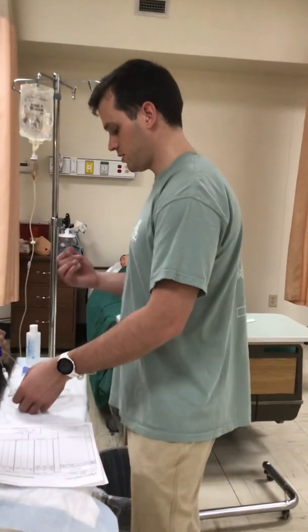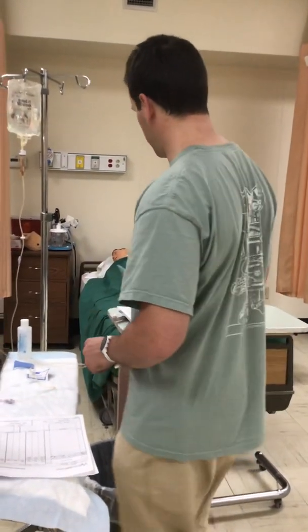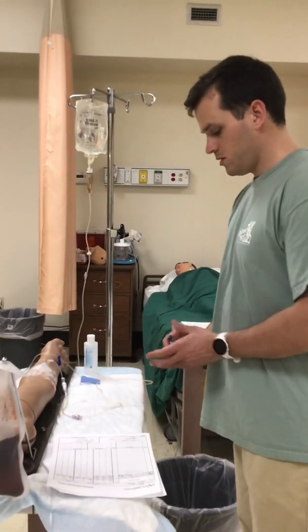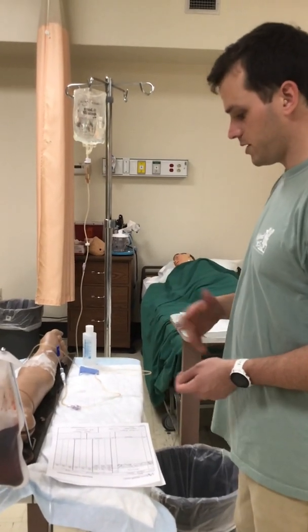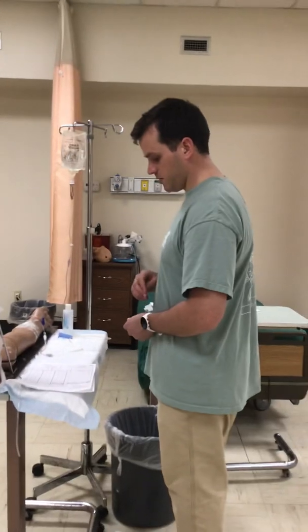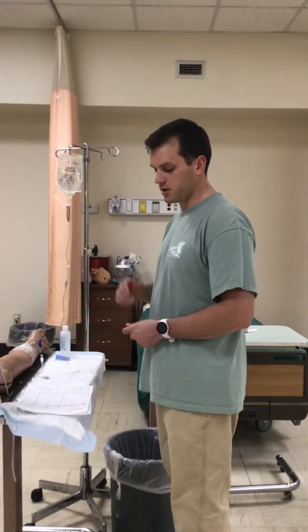So I've done this. Going to take both of these and dispose of them in the sharps container way over there. I'm going to once again ask the patient if she has any discomfort, anything I can get for the patient before I leave the room. I am then going to go and document this procedure, and of course wash my hands before leaving the room.